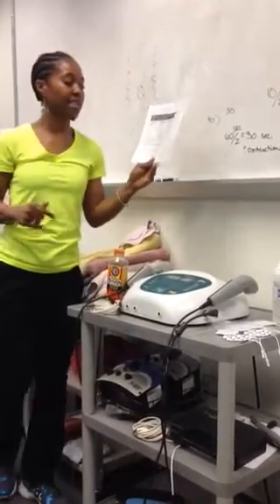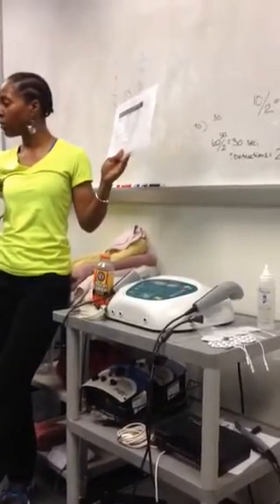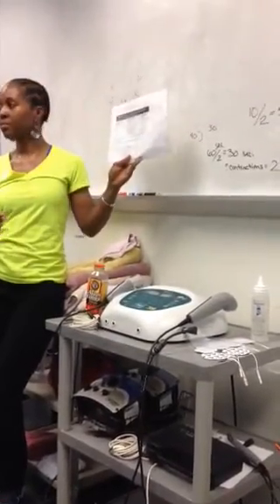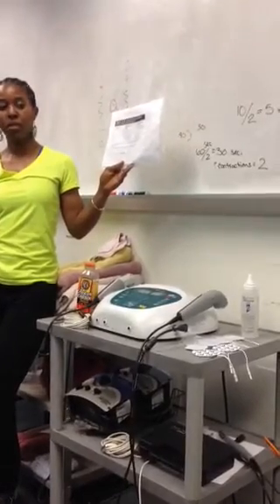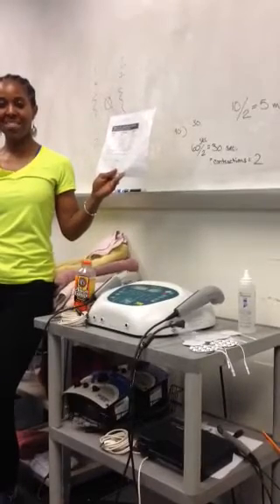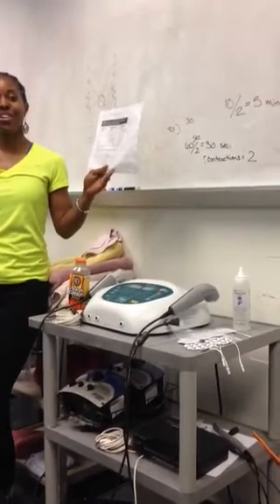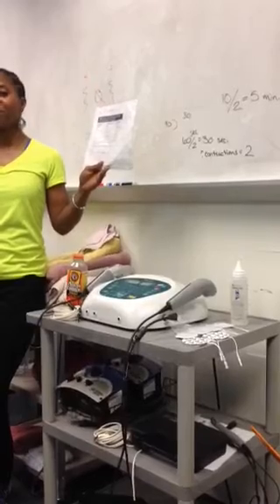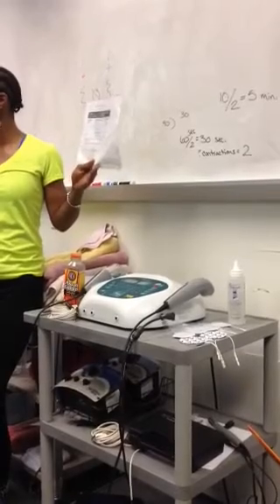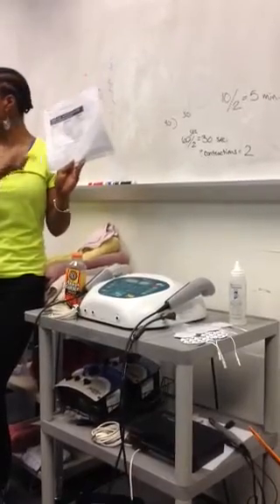So, 1 megahertz frequency. If you're reading down the chart, so 0.5, 1.0, 1.5, 2.0, what are the temperature increments? Okay, say it again with confidence. 0.04, 0.2, 0.3, 0.4. Everybody together, say it again. 0.04, 0.2, 0.3, 0.4. One more time. 0.04, 0.2, 0.3, 0.4. Okay, so do you know 1 megahertz? What is it again? 0.04, 0.2, 0.3, 0.4. Okay, and those correlate to the intensity.